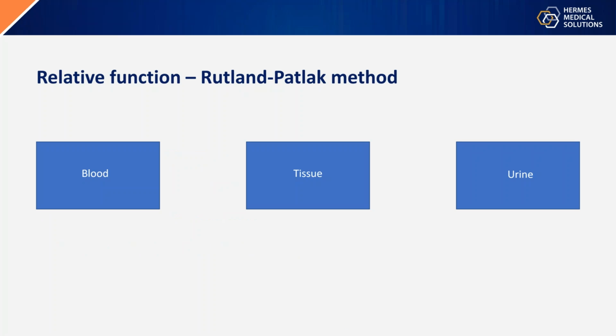So let's talk a little bit about the Patlak method now, as it is a little more complicated, but also a little more interesting. So I'm going to take you on a little detour, it's not a long one, to tell you how we arrive at the Patlak plot. The kidney system can be expressed as a three-compartment system, where activity travels between these compartments. So we have the blood, and this is both blood inside the kidneys, but mostly when we look at this system, we're considering activity outside the kidney region. So this would be outside the kidney region of interest we draw on the renogram.